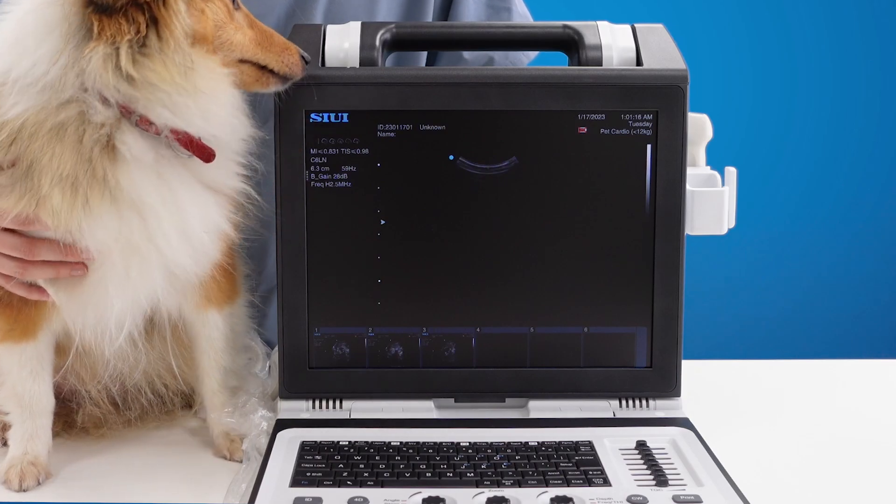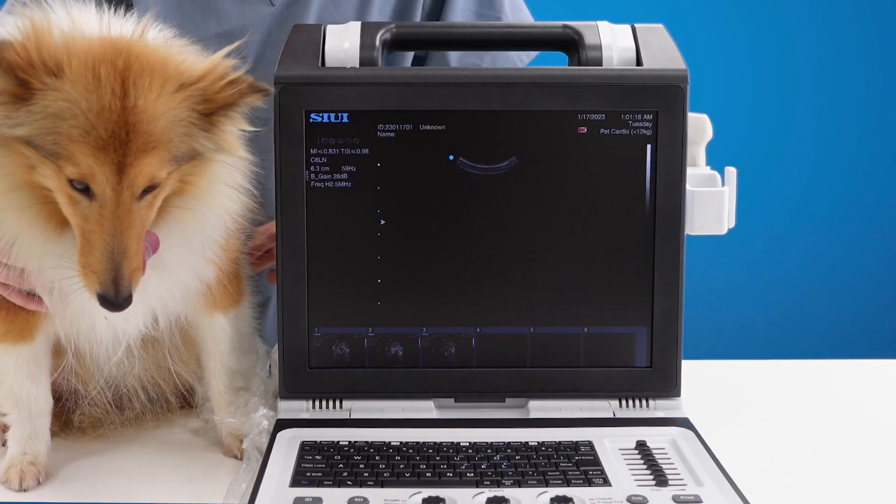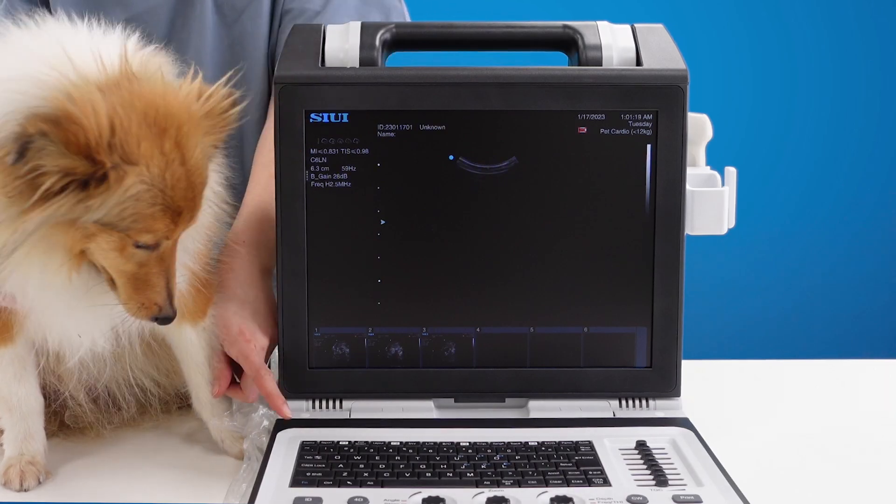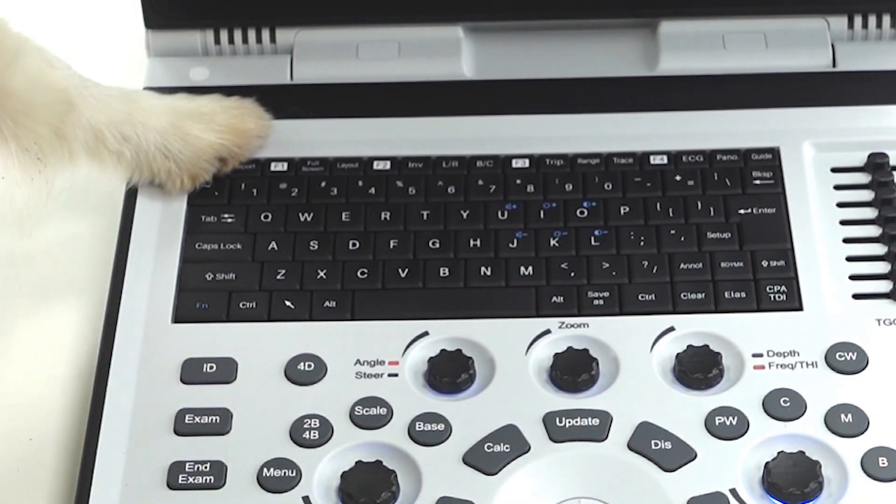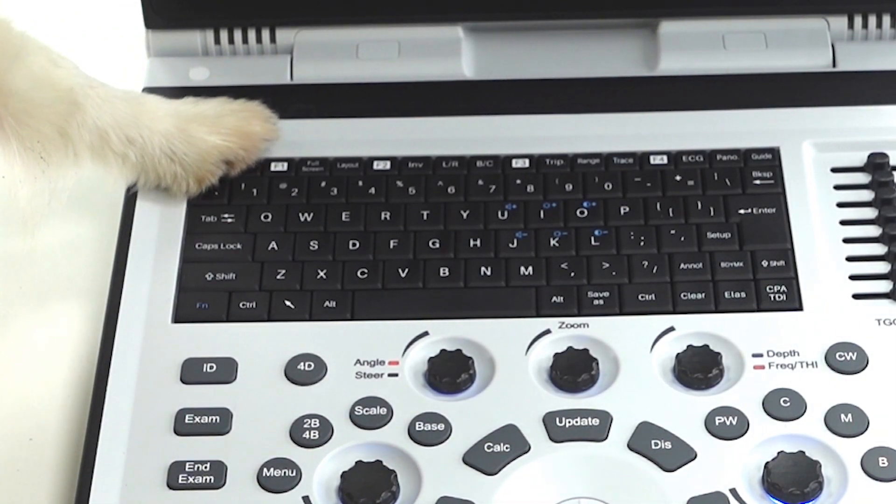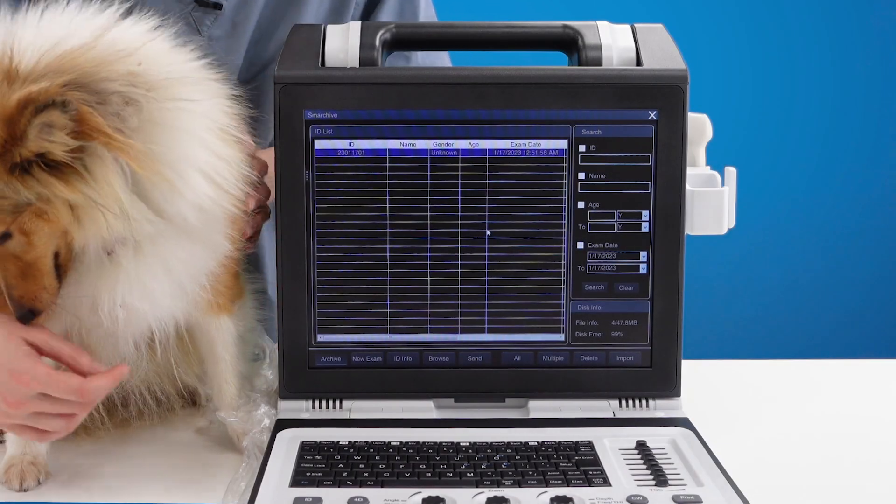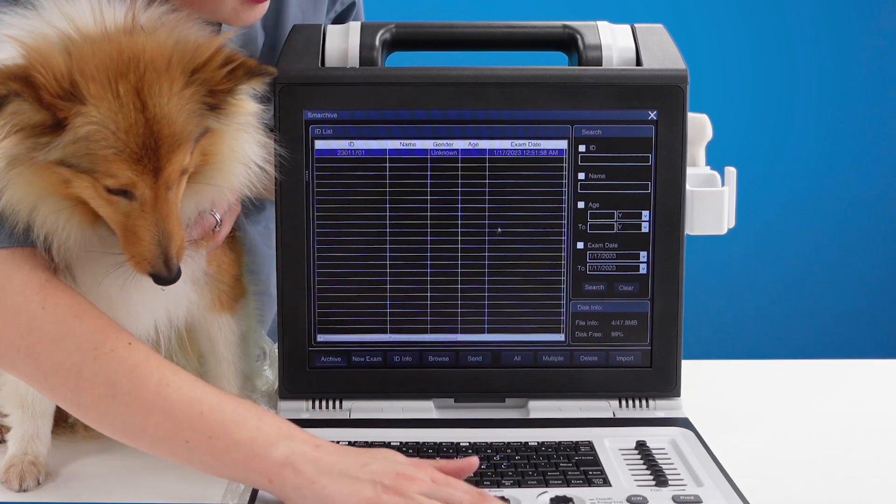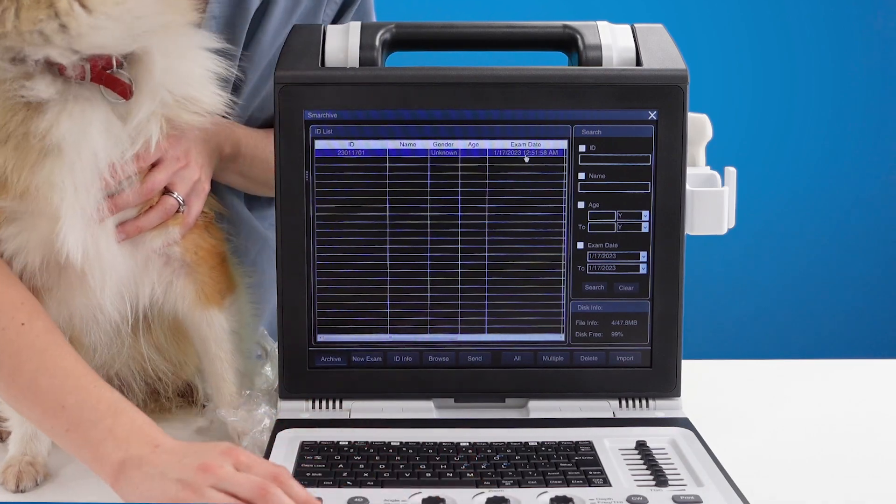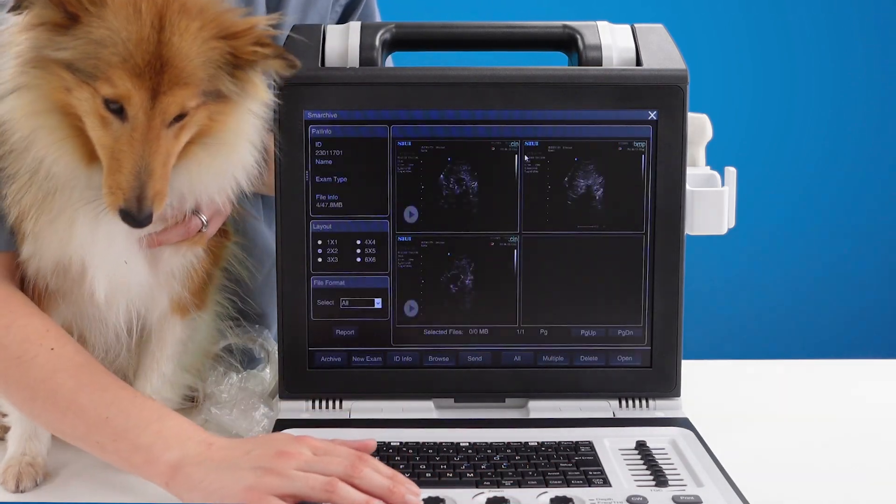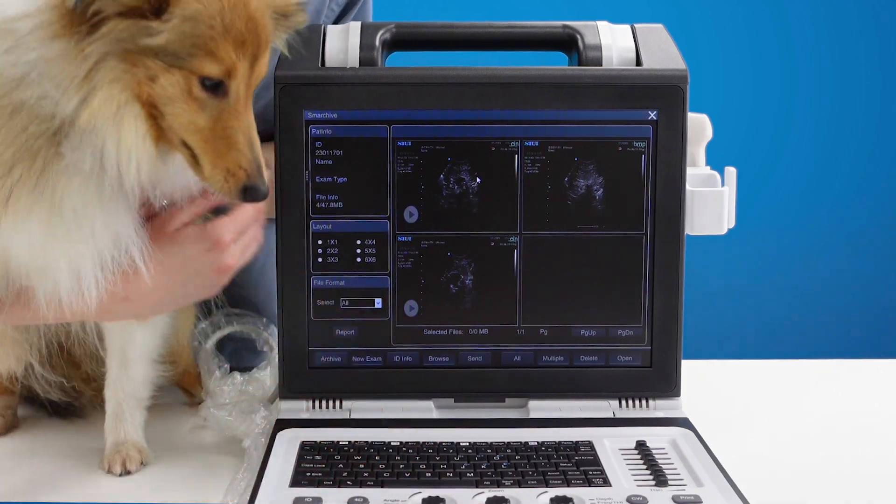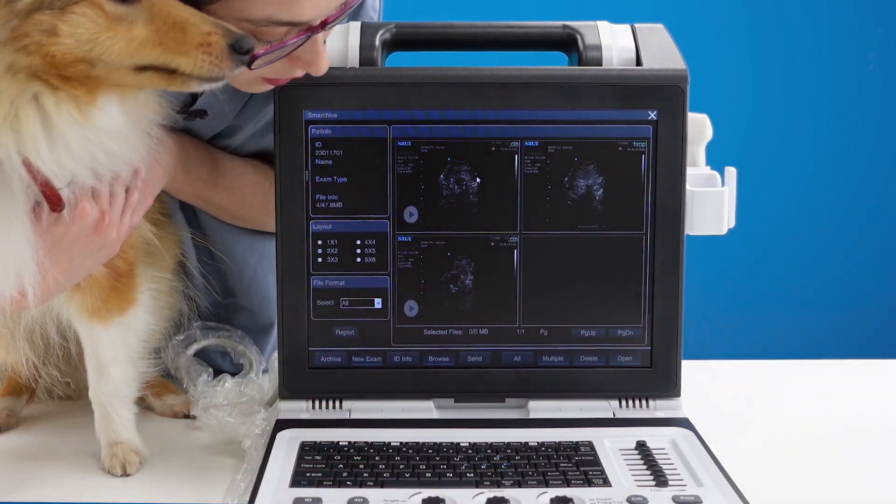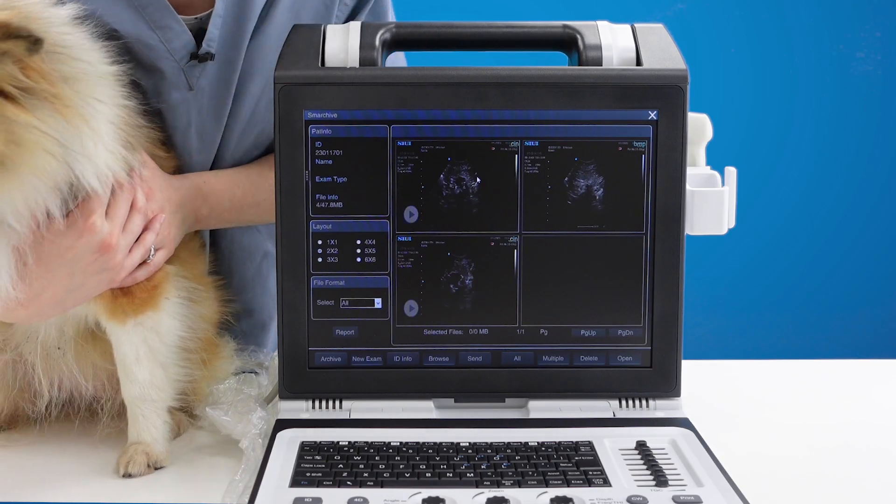To access saved pictures once you've finished your exam press the SM archive button and there you'll see a list of your examinations. You can move over, double click with set, and the easiest way to export is just to press select all and send.